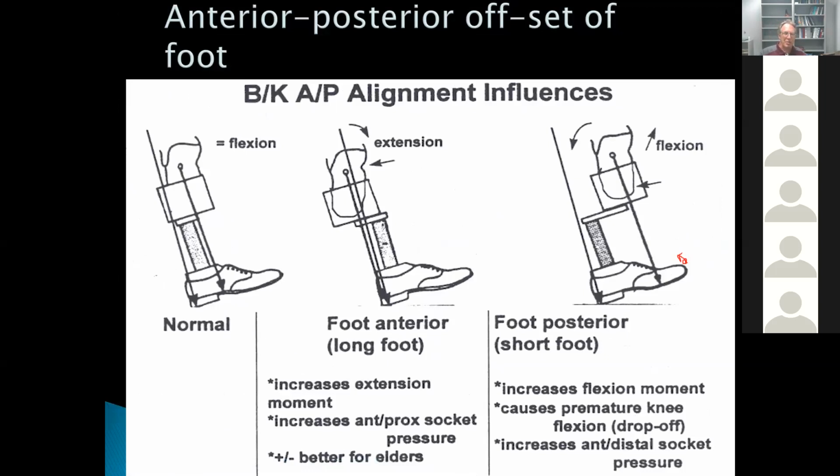Okay, so there's a couple things that a prosthetist could do with the alignment. And there's a couple of types of alignment, and Brent will talk about this in a week and a half when you meet him probably. There's what is called a bench alignment. So bench alignment is what is done before the patient ever gets the prosthesis, and then dynamic alignment. Dynamic alignment are little tweaks that a prosthetist might do in order to change the torques being applied to the residual limb by the prosthesis.